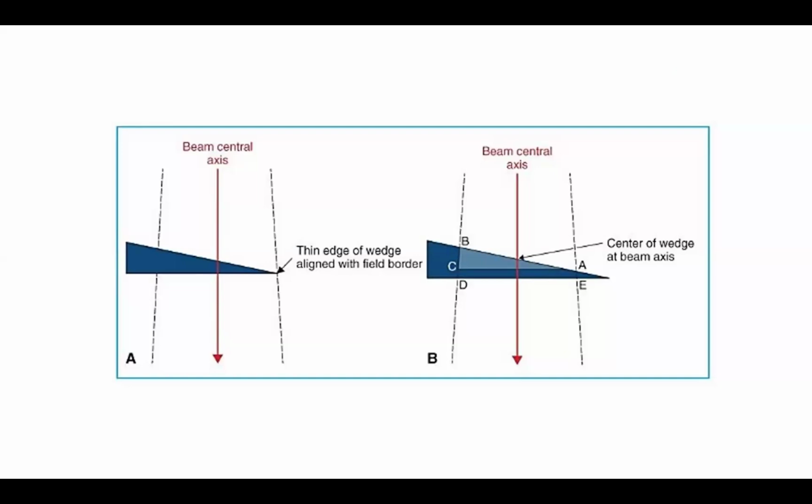And one more is the universal wedge, sir. What you said, you understood? Sir, I know theoretically, not practically, sir, that we will change. What will happen? That's what I want to tell you. What will happen during the beam delivery?